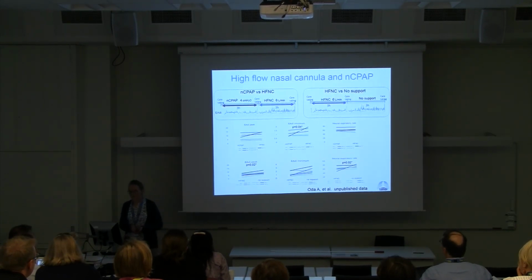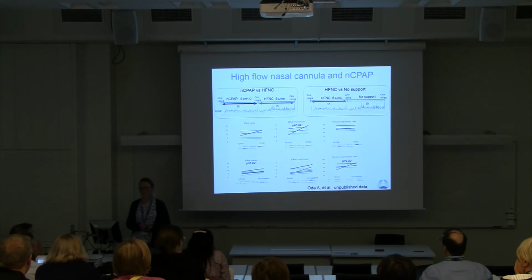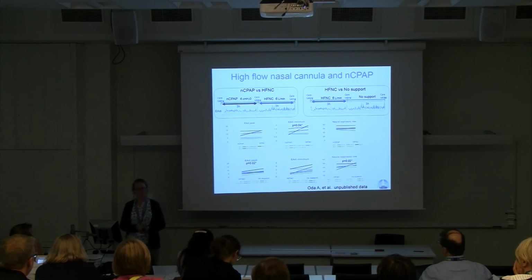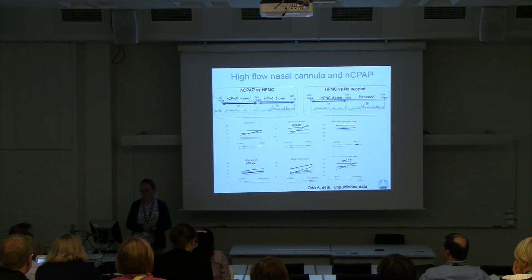With the EDI signal, we have shown that the high-flow nasal cannula has its own place between CPAP and no respiratory support when we wean premature babies from respiratory support.